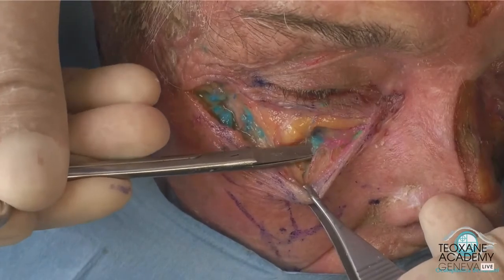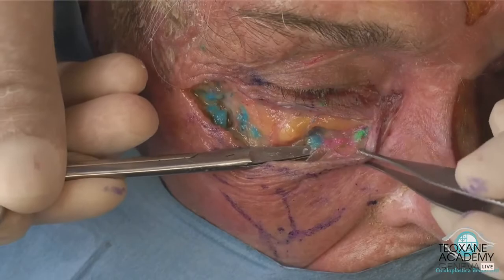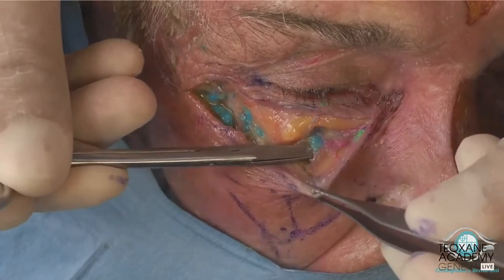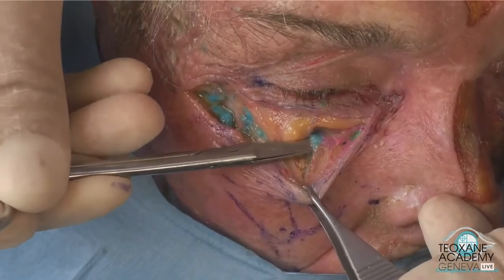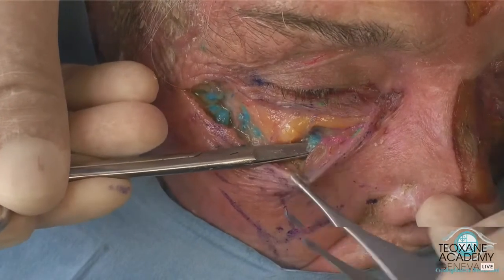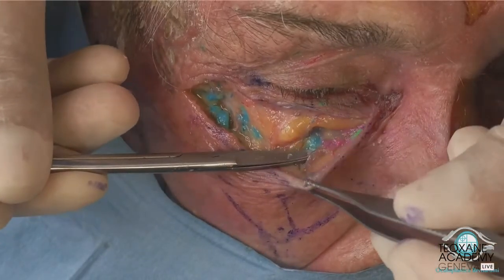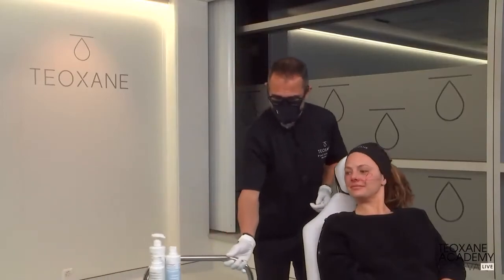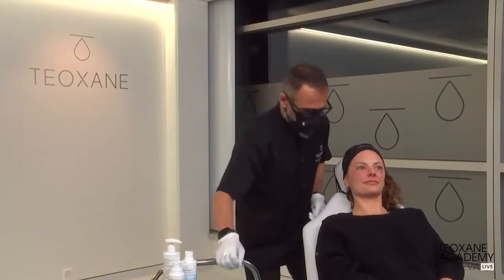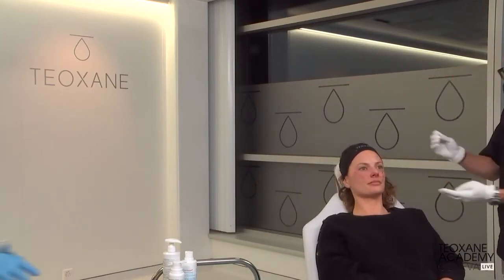So we need to come to understand that there is orbicularis fixed, attached to the bone, and on top of that there is a sliding orbicularis that moves about. So we really need to inject deep to the sliding orbicularis, but we cannot be on the bone. We are somewhere deep on the fixed orbicularis. In the meantime, I can take your questions, as many as you want, I'm pleased to, and I can treat the other side and see if I can achieve the same result.